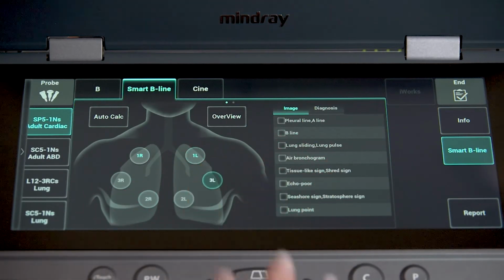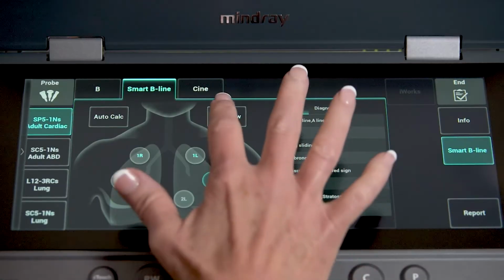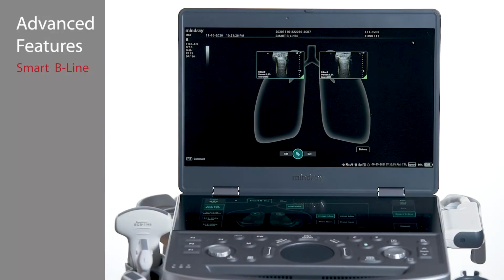Quantitative indicators, including B-line count, distance, and B-line percentage, will be displayed in the top right corner of the image. When all lung zone images are completed, select Overview to review the results for each lung zone.